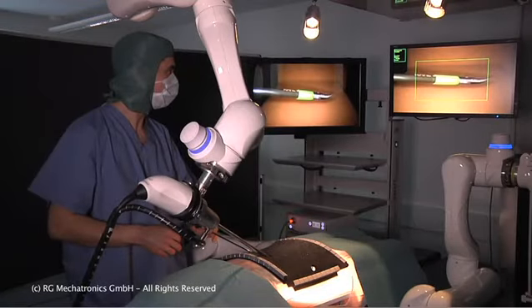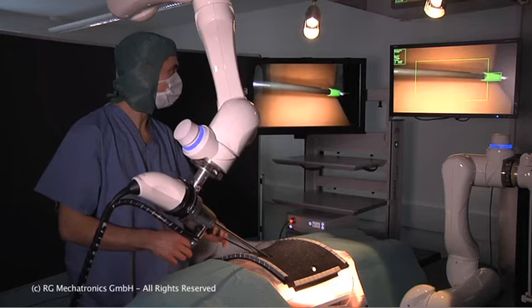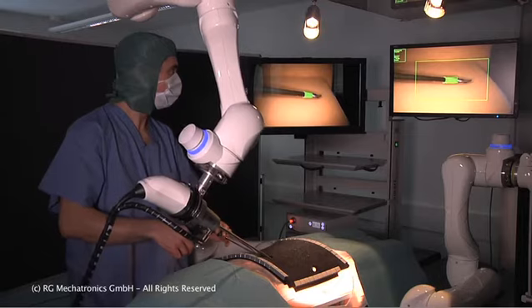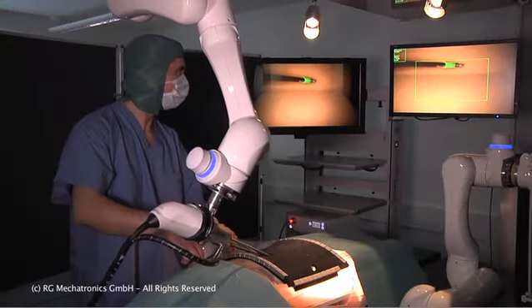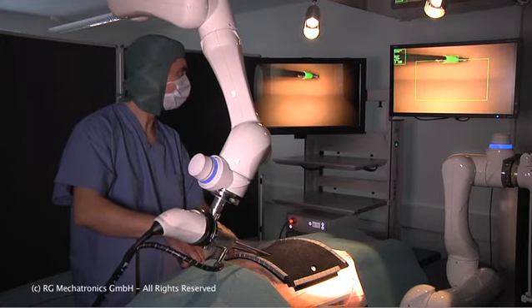Now we see a demonstration of the camera tracking function, which is intended for the laparoscopic market, principally in Europe and places outside the United States. Here, the surgeon is using a laparoscopic tool, and the endoscope is automatically tracking the position of this tool.